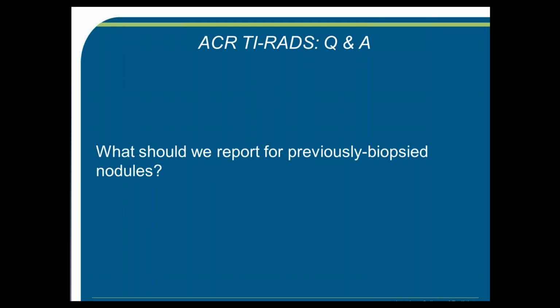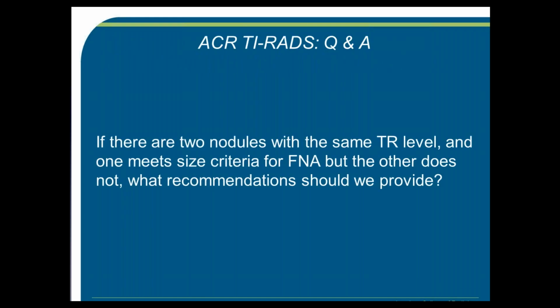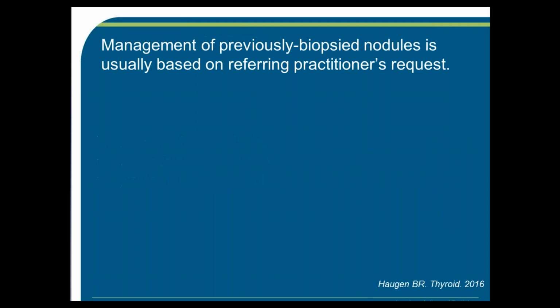What should we report for previously biopsied nodules? This is a fairly frequent question. And we said in the white paper that management is usually going to be based on the referring practitioner's request, which is going to be based on what the previous biopsy showed.